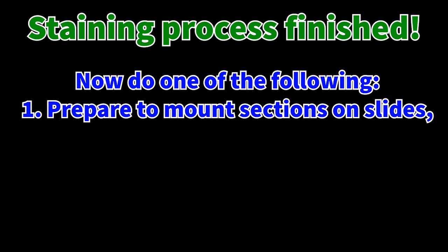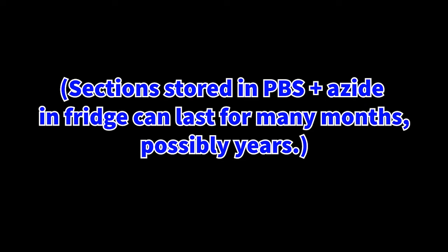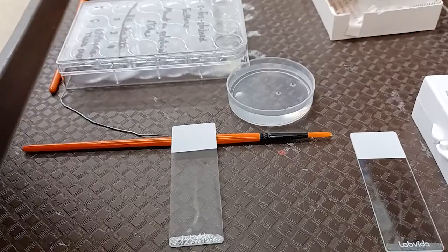That's the end of the staining process. Now you can either prepare to mount your sections on slides, or if you don't have time, put sections in PBS plus azide and store them in the fridge in an airtight container to prevent evaporation. Sections stored in PBS plus azide in the fridge in an airtight container can last for many months, possibly years, without degradation. Regardless of whether you store the sections and mount them later or mount them right after staining, here are some examples of how to do that.